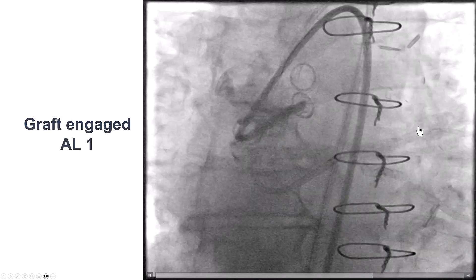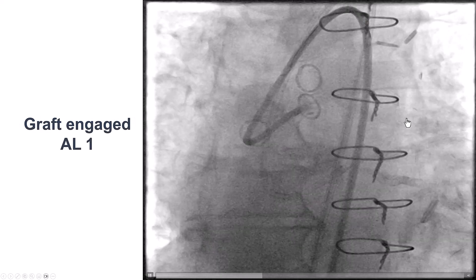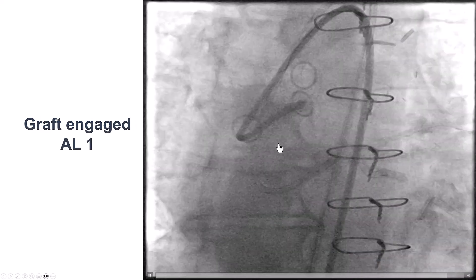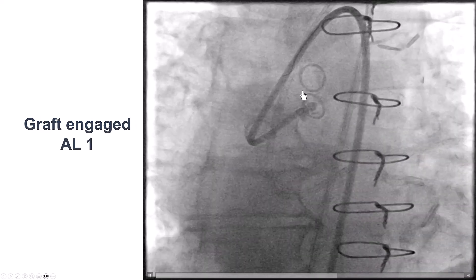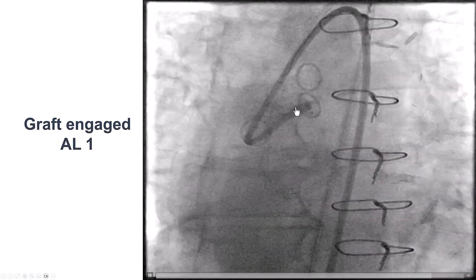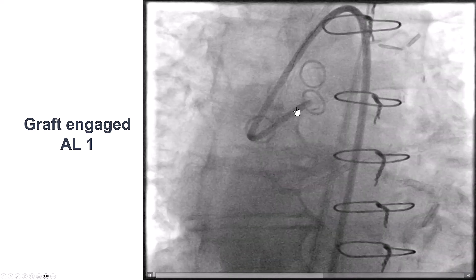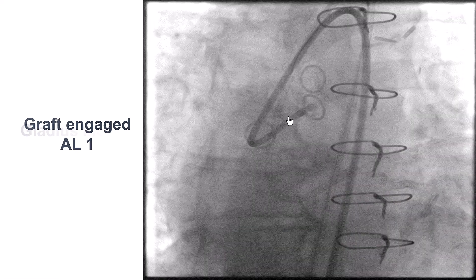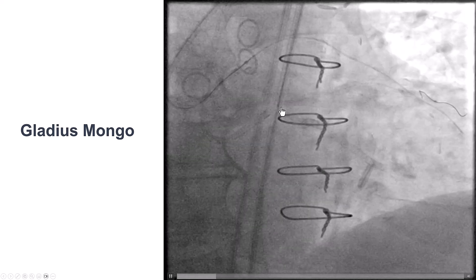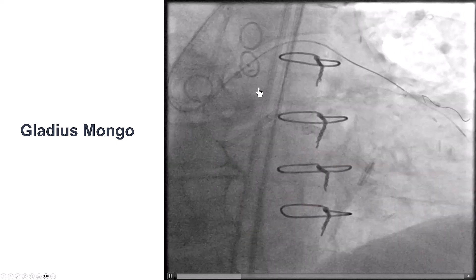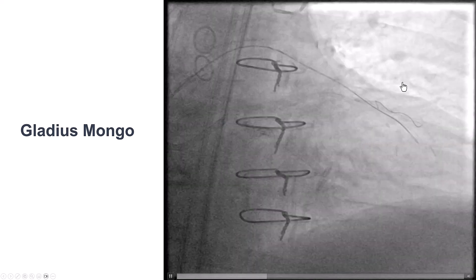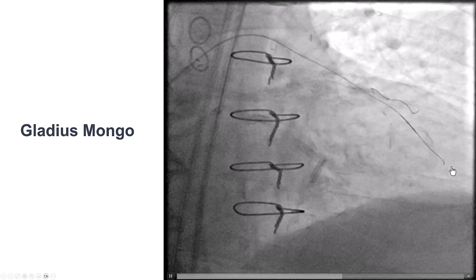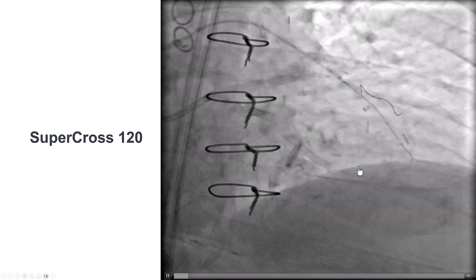We then decided to try to go through the occluded bypass graft. This is the origin of the occluded saphenous vein graft to the LAD. It was engaged with an AL1 guide. We used a Gladius Mongo guide wire, and that made rapid progress distally into the distal vessel.